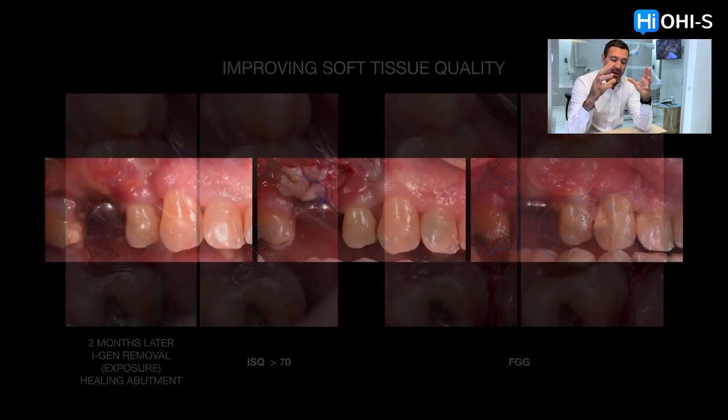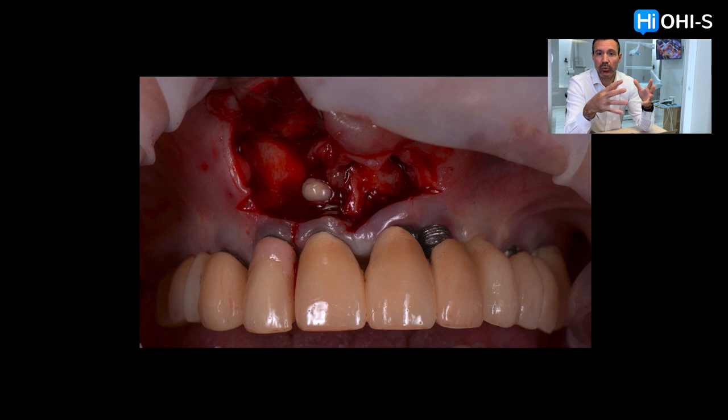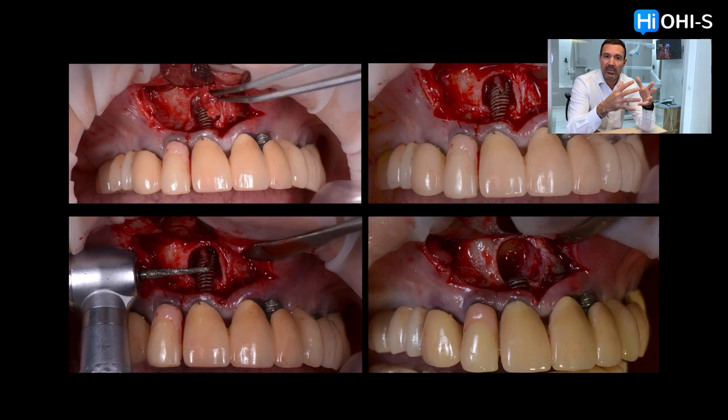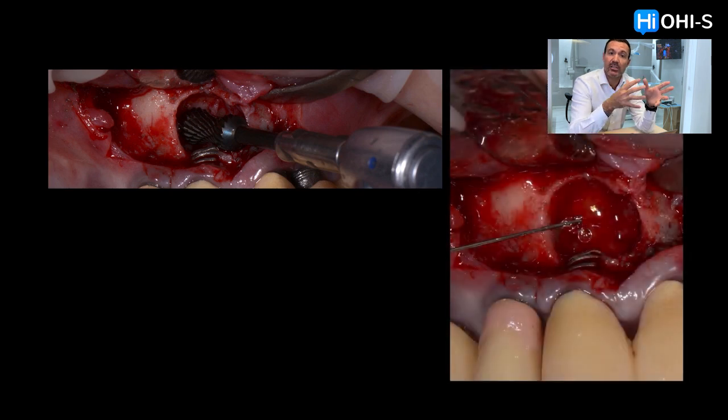The levels of osseointegration to fully understand the removal options. When am I going to use a trephine? When am I going to use a retrieval kit to just counter torque the implant and have an extraction and implant placement that is very atraumatic? I'm going to be predictable at that point. There is a reason why sometimes those implants cannot be removed by just trying to counter torque them. If we understand the biological reason, we're going to be more predictable at the time of extracting that implant, using specific techniques and following step by step.